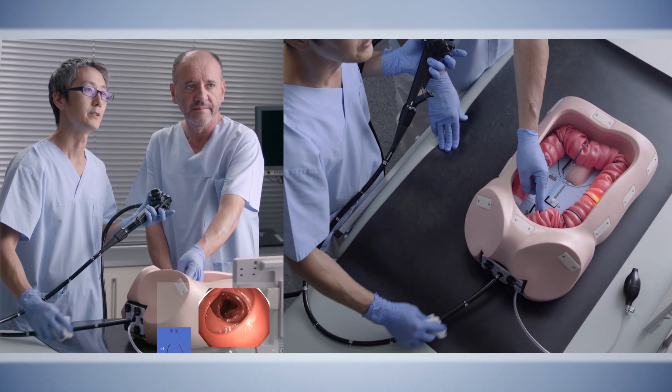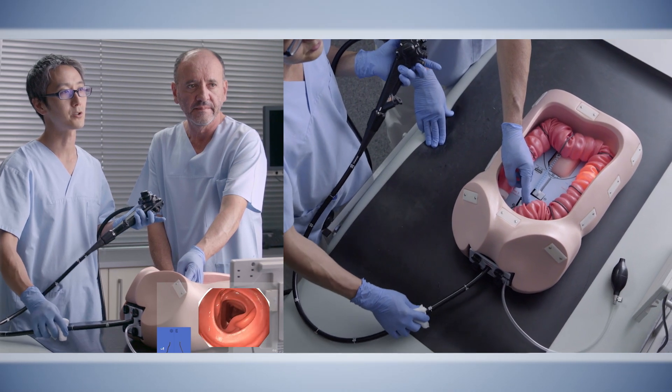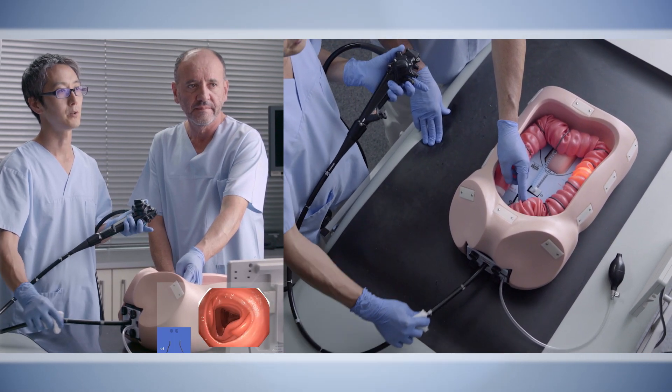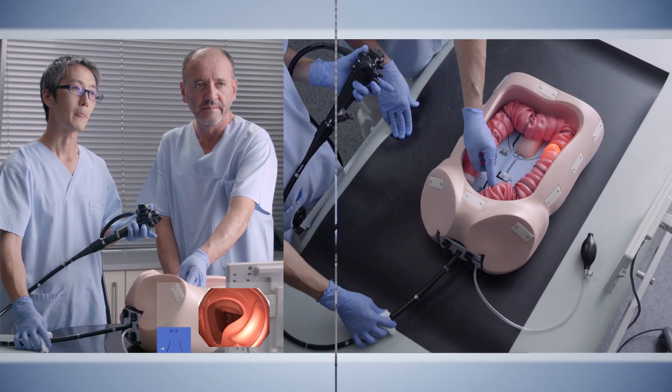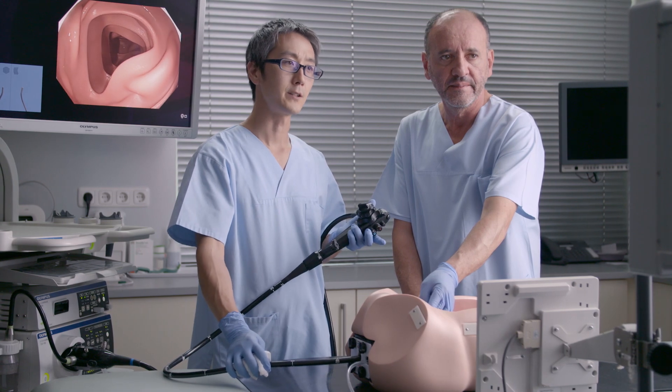As you see, we pass the sigmoid descending junction into the descending colon without a loop, and confirming one-to-one here. This is the end of exercise 2.